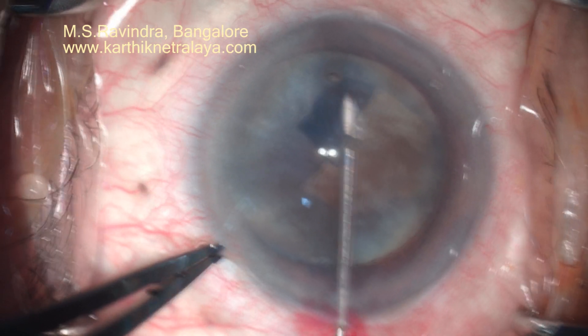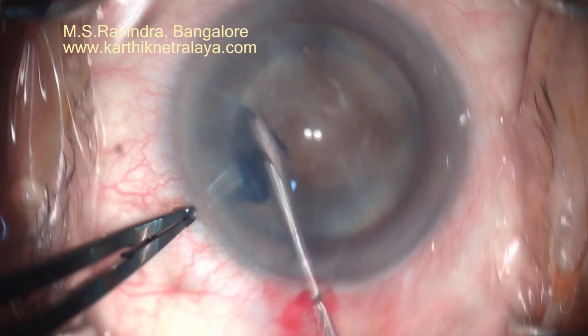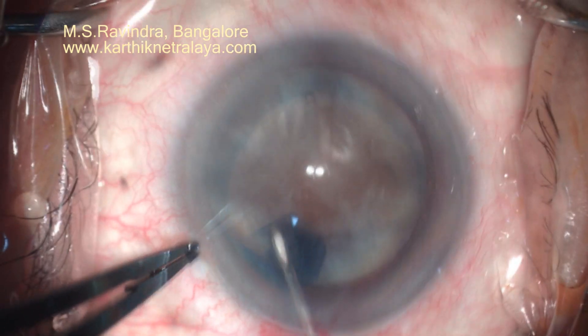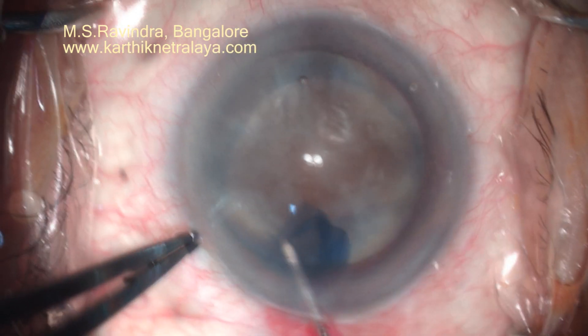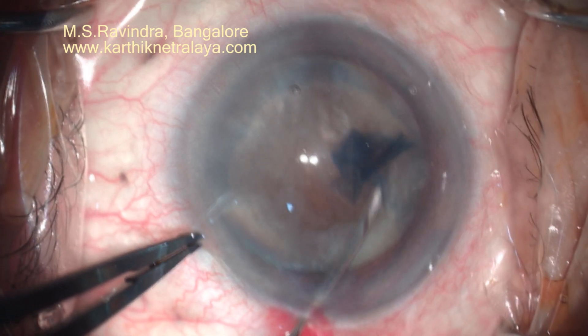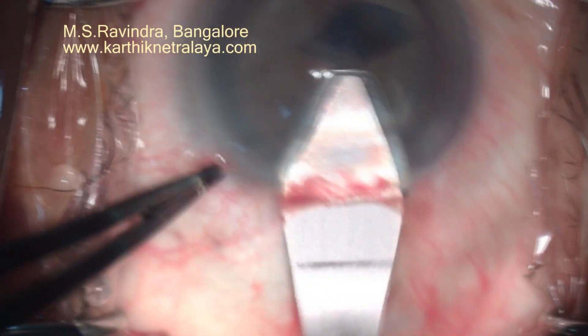I am tentatively making a very large rhexis so that I am not going to jeopardize the zonules when I am extracting the nucleus. As the cataract is not bulging, the rhexis is pretty easy. There is no fluid — the entire thing is nucleus.